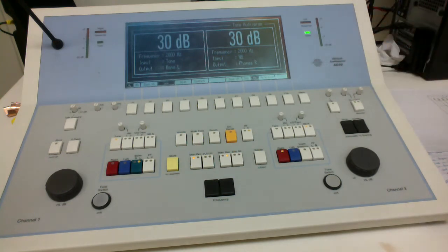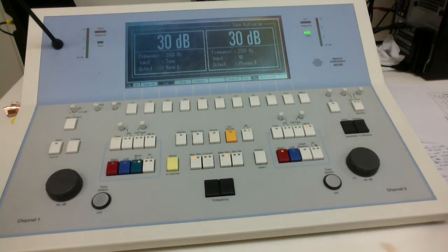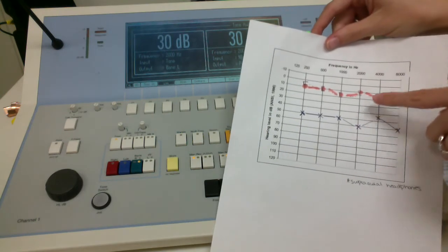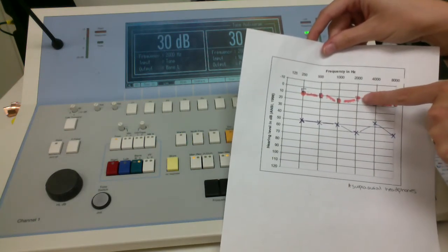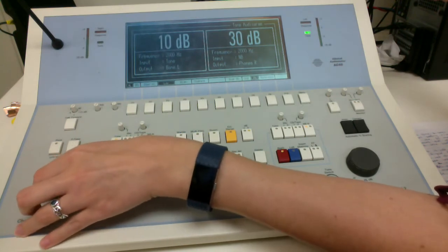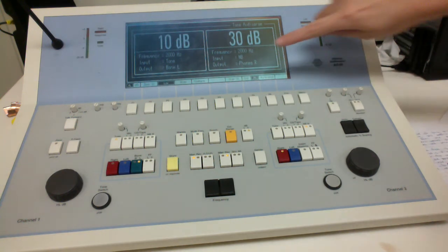All right. So our left ear is set at that 2000 hertz, and we're going to be changing the intensity of the masker to the bone conduction threshold of the non-test ear. So the right ear at 2000 hertz was 10. So the masking noise will be a narrowband noise at 2000 hertz.